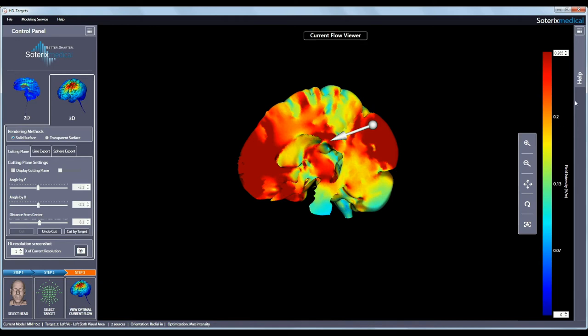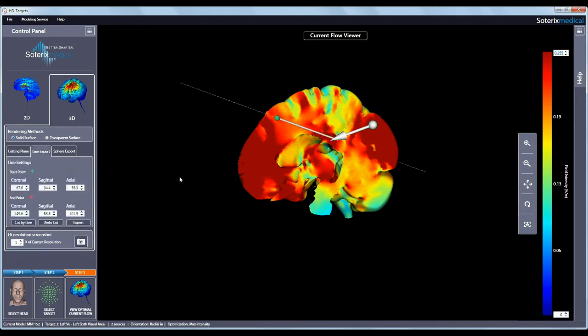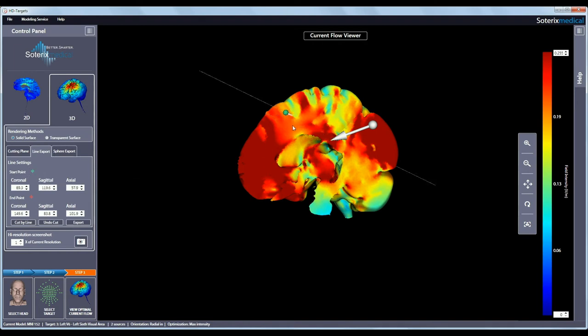The field intensity scale can also be adjusted here in the same way as the 2D view. The line export option lets you define a line anywhere in the 3D volume and export the induced electric field values along it to a text file. You can set the start point by clicking on the green crosshair and clicking anywhere in the 3D space to define the start coordinate. You can also manually enter the start coordinates.